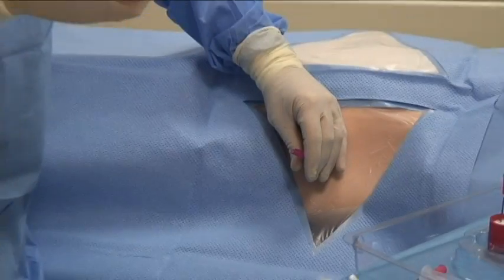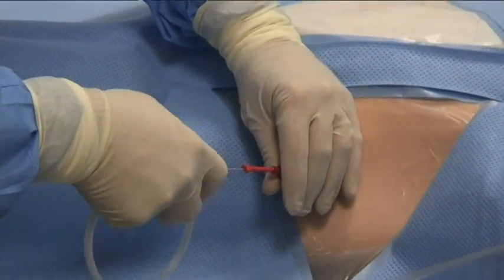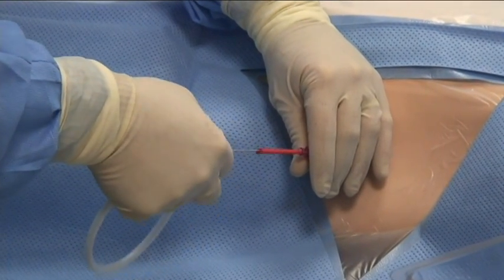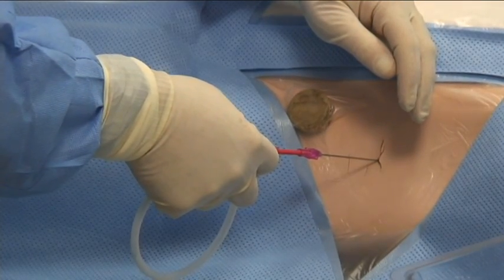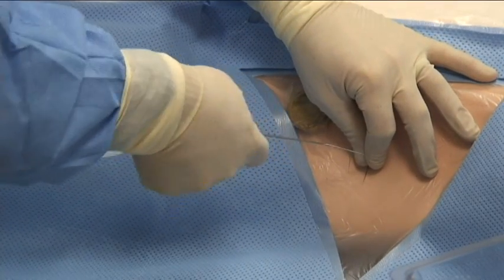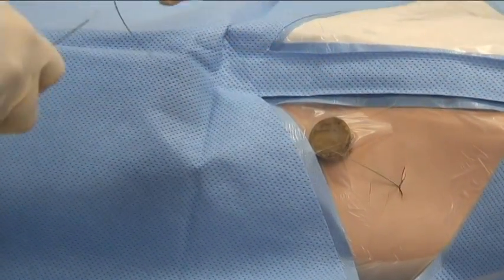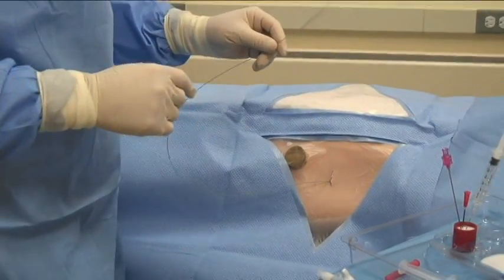Now, this is a Seldinger technique, so I'm going to take that guide wire, and I'm going to gently insert it through the needle. Now, you don't need to put the wire all the way in. You just need to go a few centimeters past the tip of the needle. So once the wire is in, I can remove the needle, holding the wire, and have my wire here in my hand. And put the needle down into the sharps disposal.